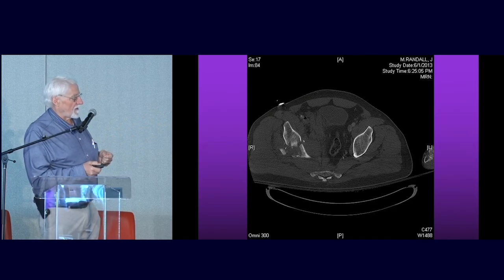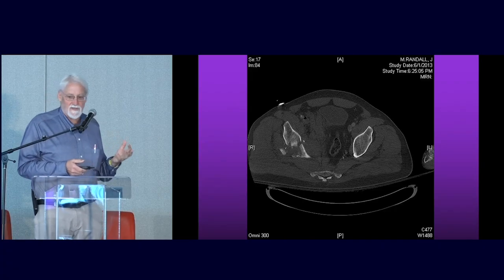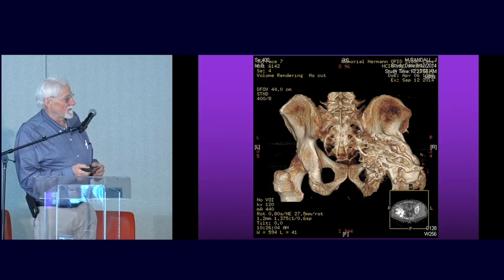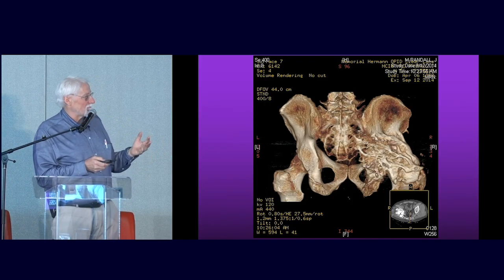And if you don't address it, and this is a younger guy, you maybe could have done that. I said, well, it's this impaction. You never reduced it. And he goes, no, that's not it. And I'm like, okay, never mind. So he asked for my help, and then he didn't. But you can see that, this one was harder to see, but there is an impaction there that's just not reduced.